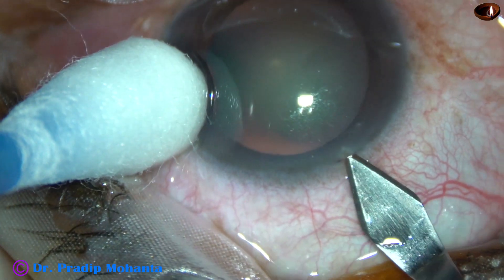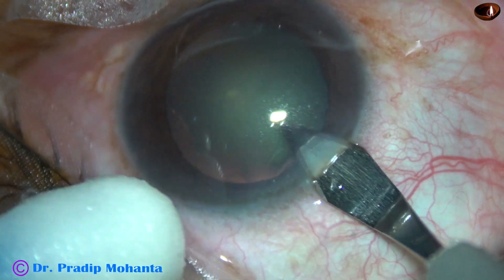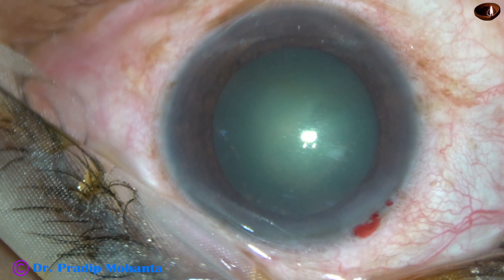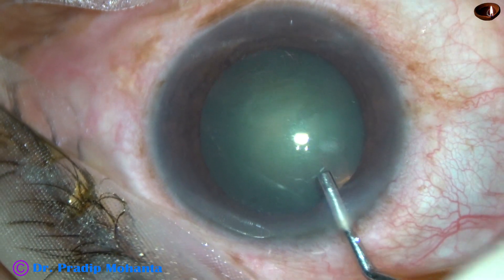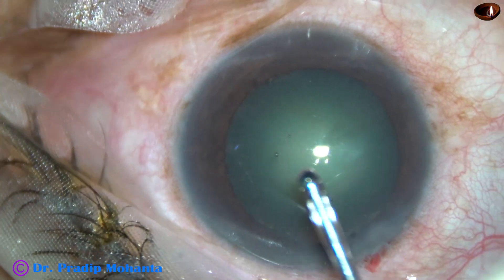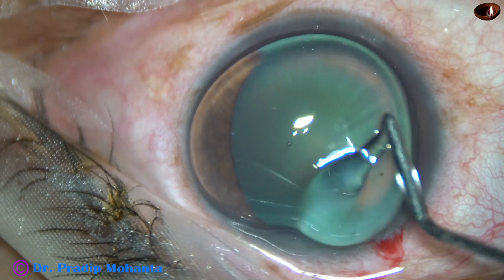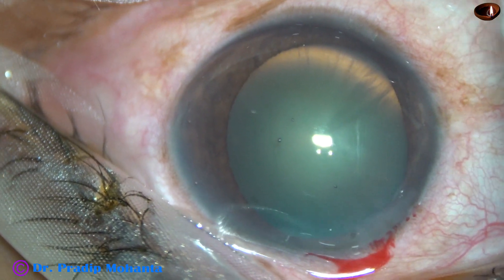This is the main incision with a 2.8 mm steel keratome. The microscope doesn't have a stereo coaxial system and red glow is poor. But still, we can do rhexis without using trypan blue dye. Apply some viscoelastic over the cornea, and visibility improves a lot. We can see the anterior capsule very clearly.